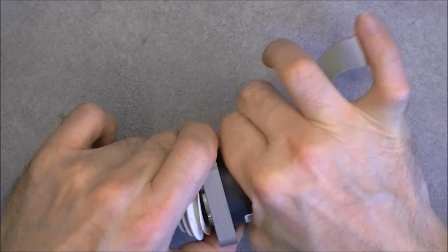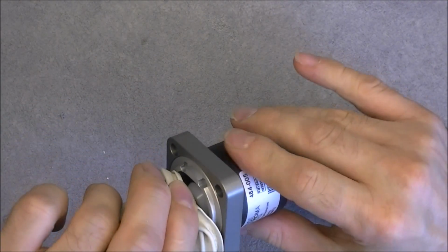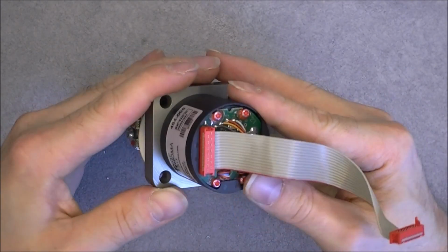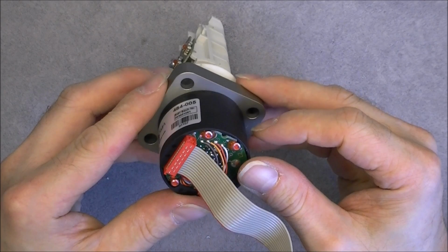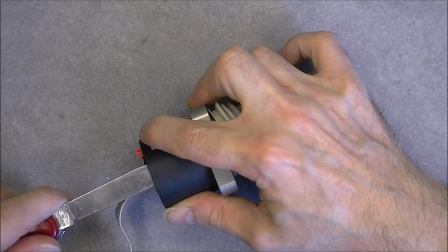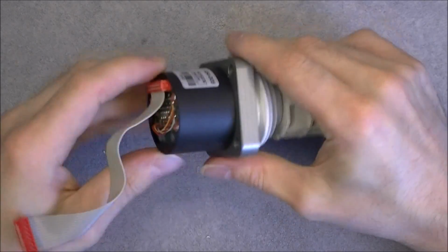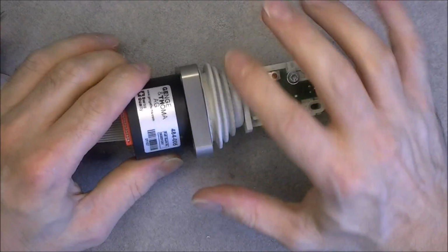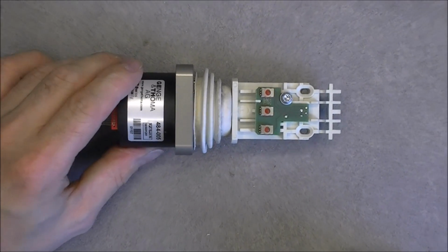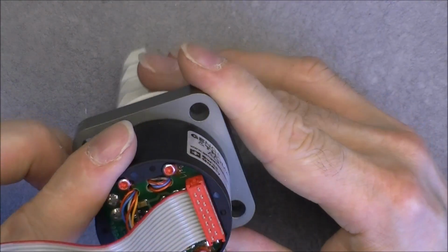But it is interesting. No, really, it will not come off. And it seems delicate, so I will try to avoid breaking it. Maybe if I do this. No, so it is not sure how it comes apart, so I will not tamper with this one. I will do it with another one in a worse condition. Because I have a feeling this is a very expensive part.